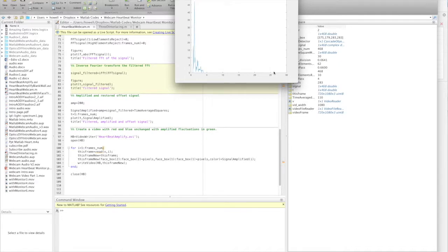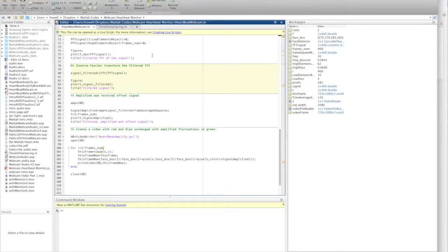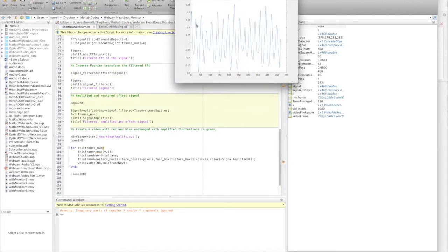In this section, we perform the inverse fast Fourier transform on the filtered frequency content. This now gives us a time signal again. Let's run in advance. You can now see that we have a much cleaner time fluctuating signal.